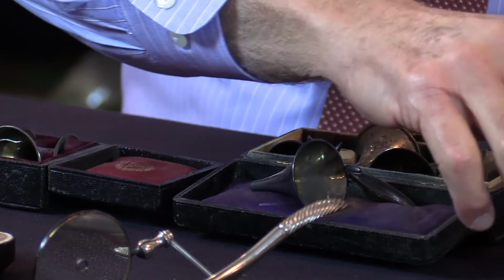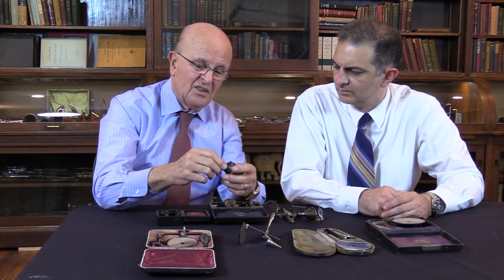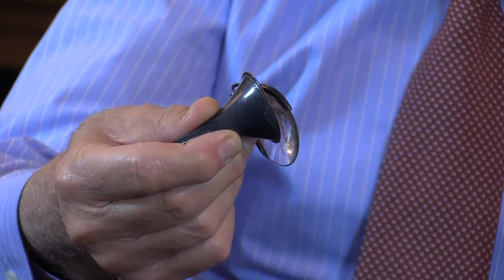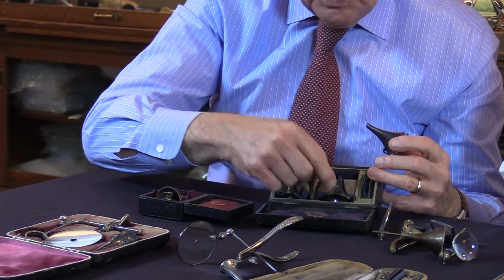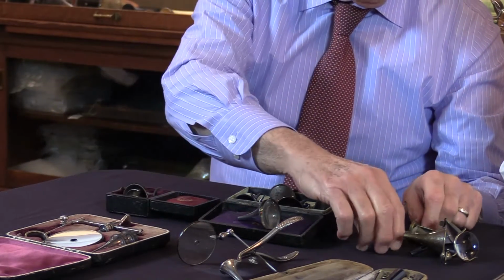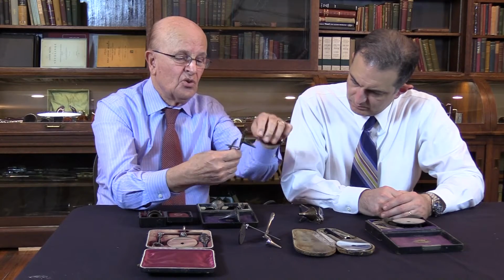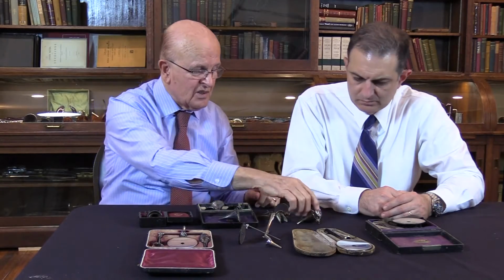So this is one of the earlier ones that I'd like to show you here. The ear speculum, and this here, you can remove it and put higher magnification or lower magnification. The set here has all different size speculum. They come in a big set like this or a small set with only one ear speculum. I found this fascinating because it's a bivalve, and it's the screw that opens and closes the speculum, and then you swing the lens to see the magnified eardrum.